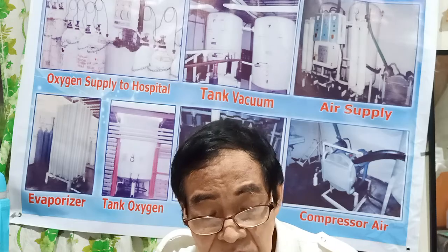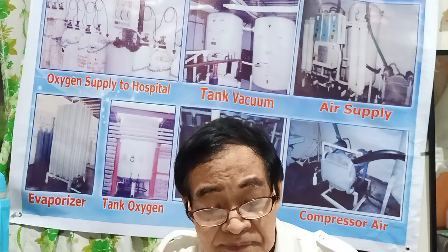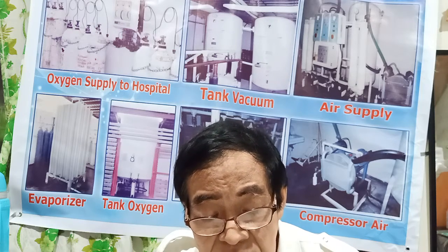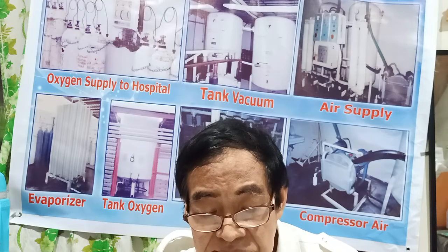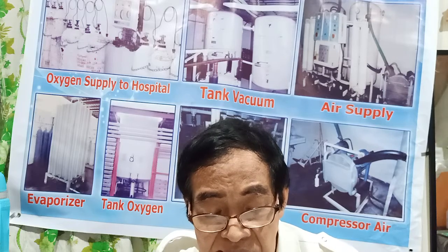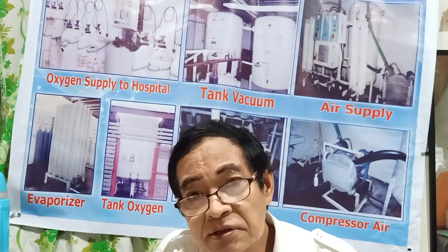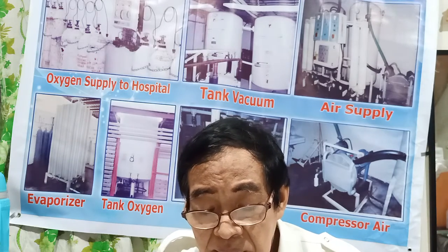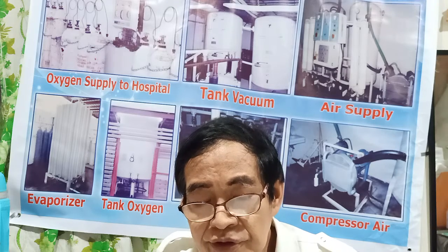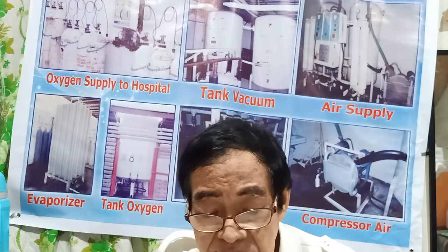Okay. Bursting pipe. In bursting pipe, this is a connection from the tank, oxygen. Cryogenic liquid closed in the pipe system within two valves will expand very rapidly as it is heated and turned into gas. Very difficult. That is secure your preventive maintenance of a technician.